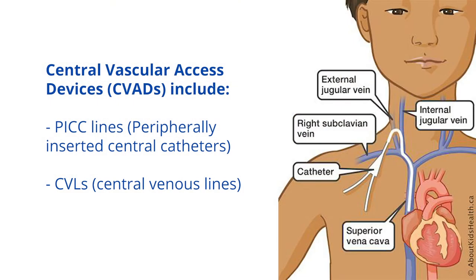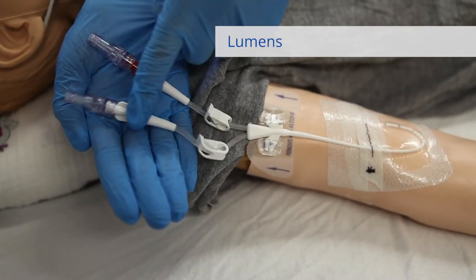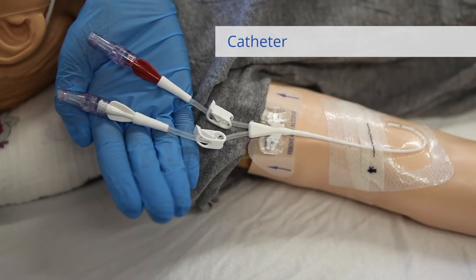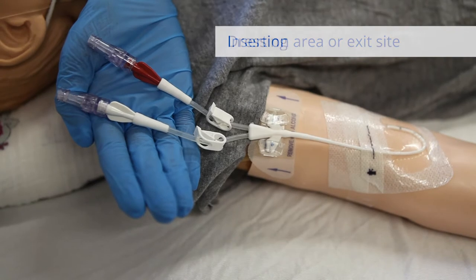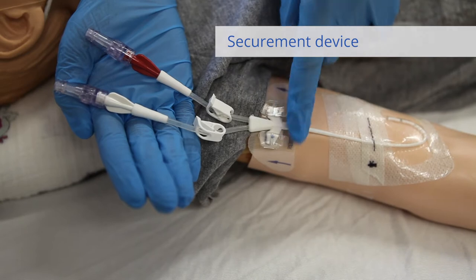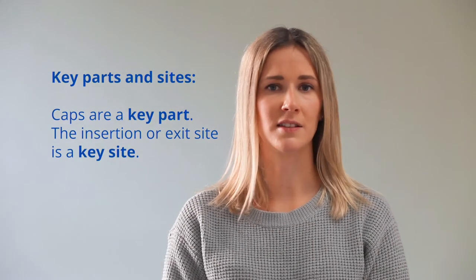A central vascular access device, or central line, has the following parts: clamps, lumens, catheter, and access caps — which are considered key parts — an insertion area or exit site, which is a key site, a dressing, and a securement device. Caps are considered a key part of the CVAD, and the insertion or exit site is considered a key site.